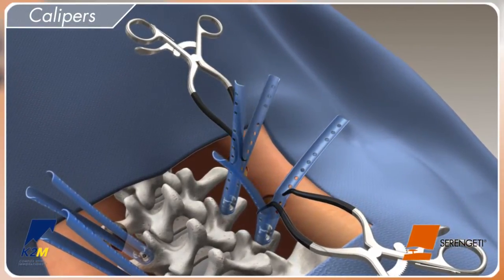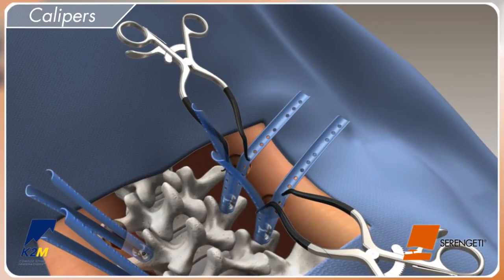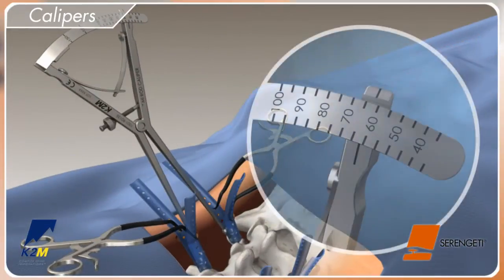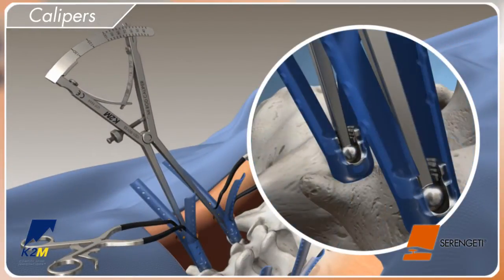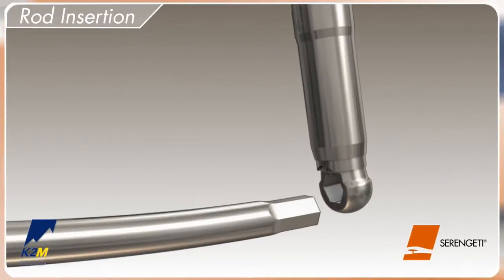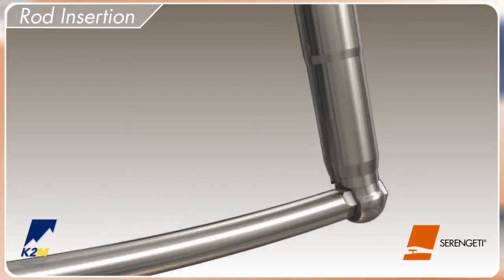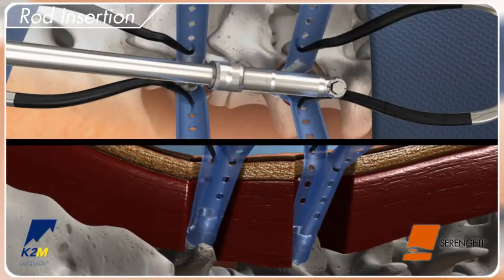This allows for direct visibility and access to the screw head for easy rod insertion. Place the MI rod calipers into the most cranial and caudal screw housing to determine the appropriate rod length. Load the hex end of the rod onto the rod inserter and secure by fully tightening the dial at the proximal end of the inserter. Place the rod into the Serengeti retractor and down to the saddle of the first screw.